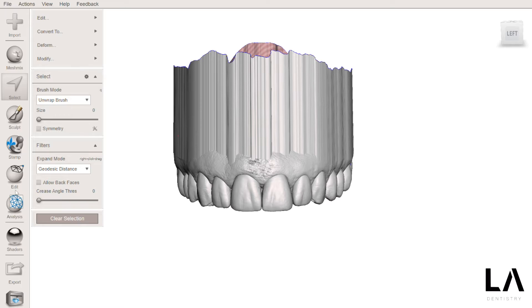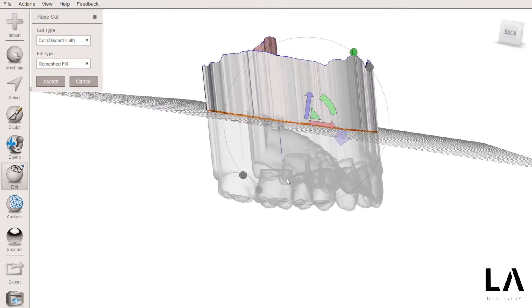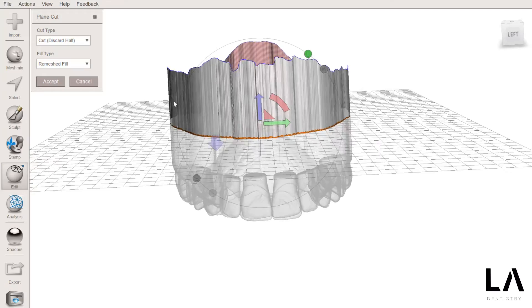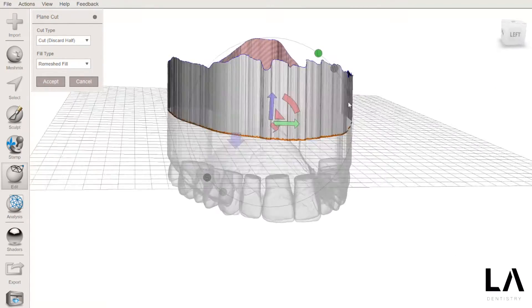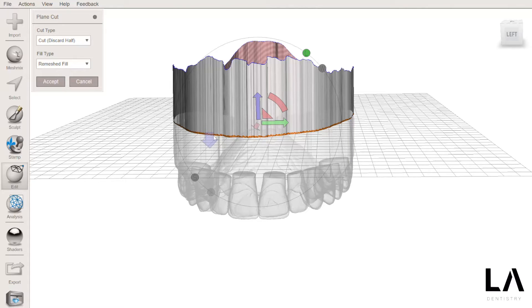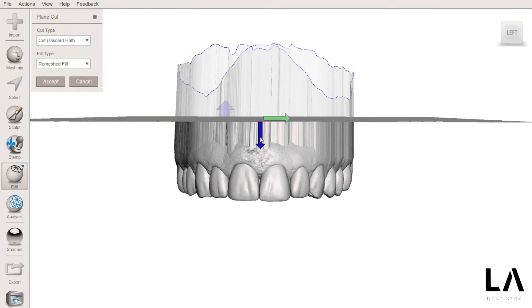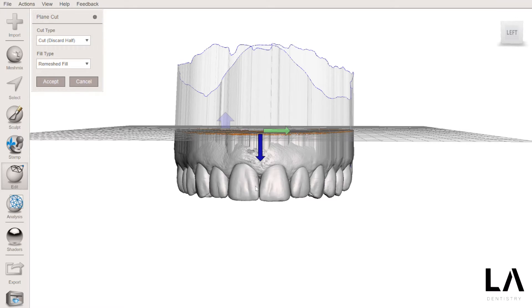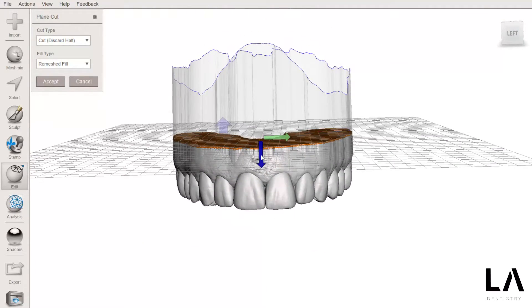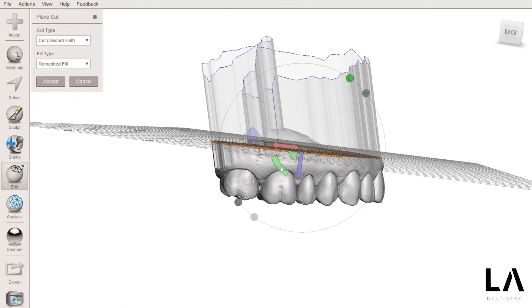Now I go into Edit and go to Plain Cut and I will make a smooth cut. The transparent part is the part that will be cut off, and the gray part will be left intact. I want to keep the teeth, so I'll click on this blue arrow and it will flip the sides. Now I can adjust the position of this plane that will perform the cut. In this case, I want a little bit of the palatal surface because this is a mock-up model — I want to make sure I have some support for my silicone matrix.